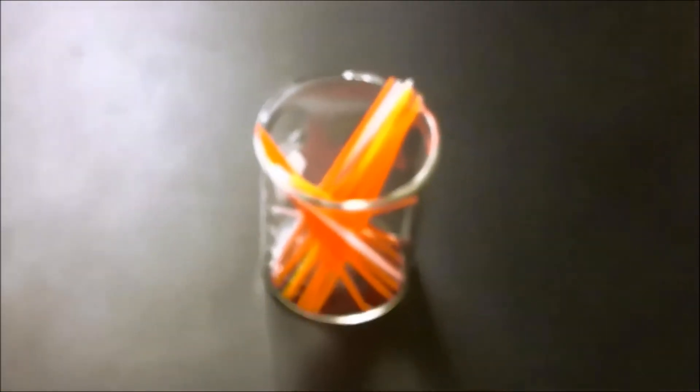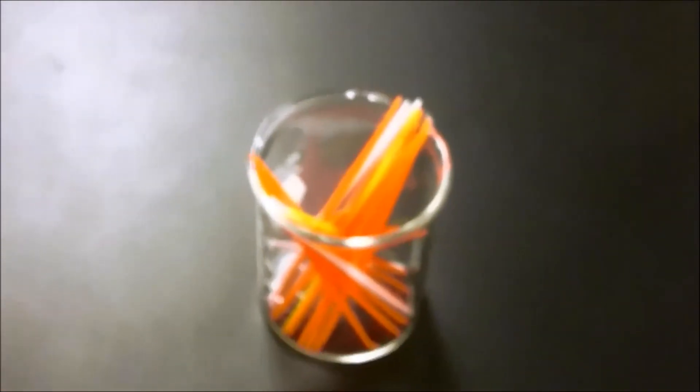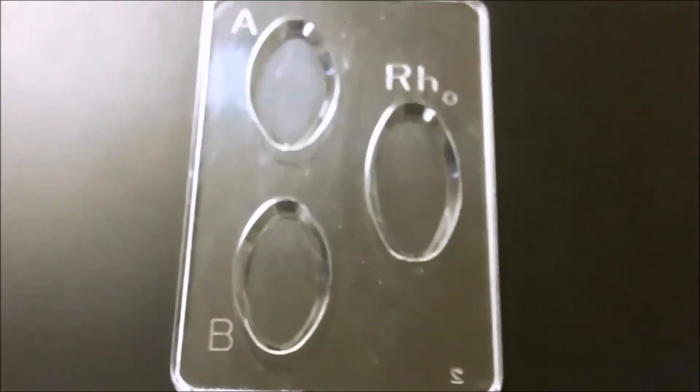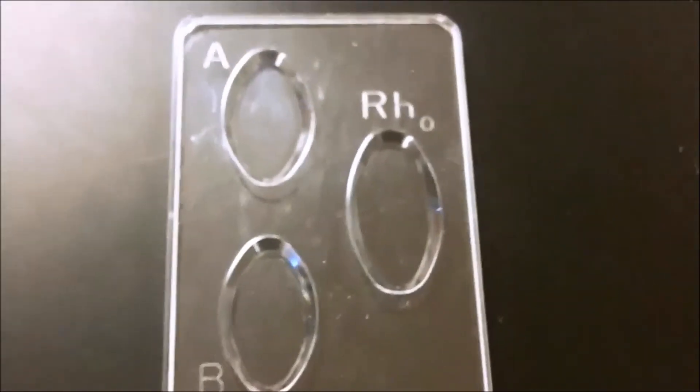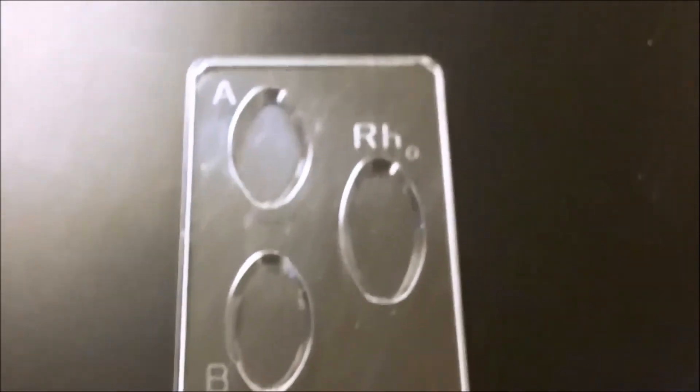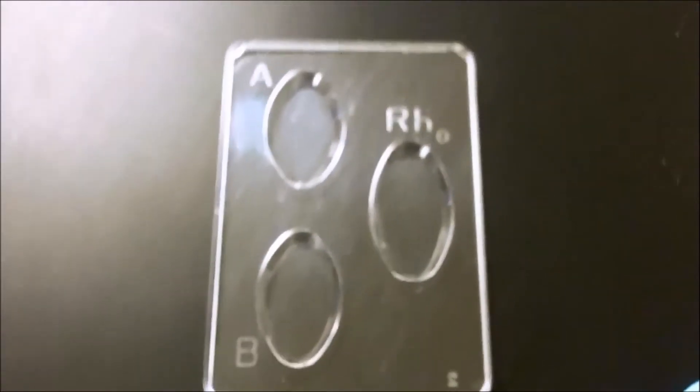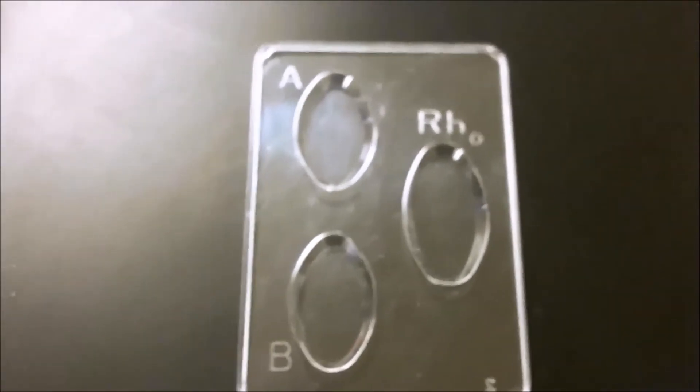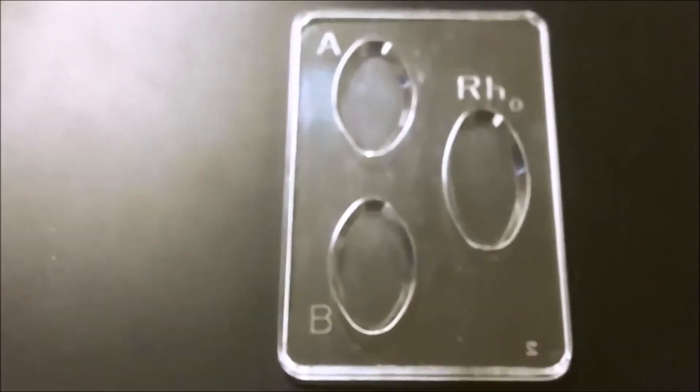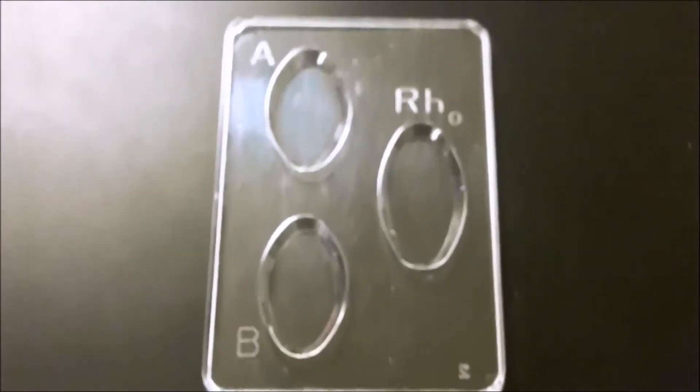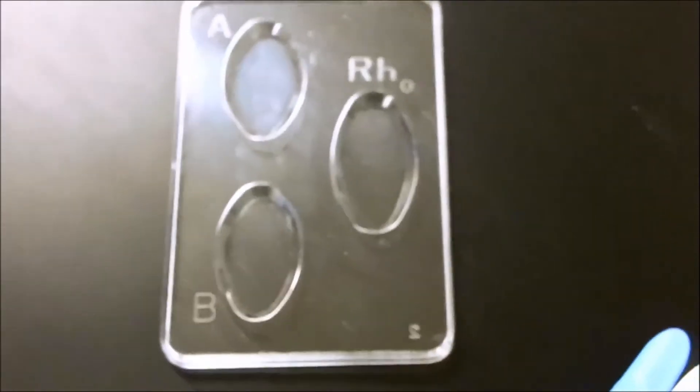These are plastic throwaway toothpicks for stirring, so we would use one, throw it away, use one, throw it away, so that we don't cross contaminate. So I'm going to prick my finger. I'm going to put a drop of blood in each of these wells. Then I'm going to add a drop of RH and anti-B and anti-A to the appropriate tubes, stir them, or the appropriate discs, stir them, and we'll see if we get clumping.